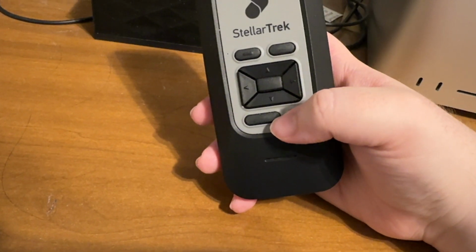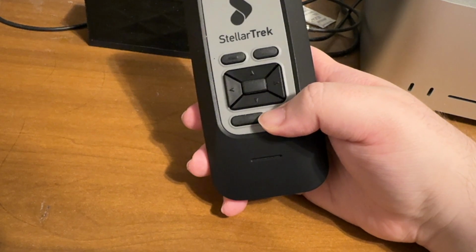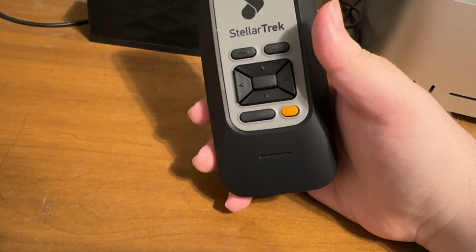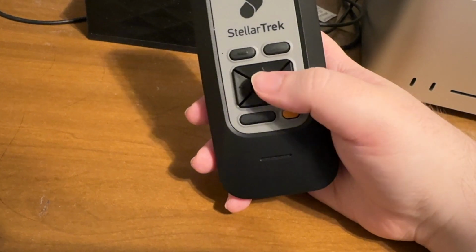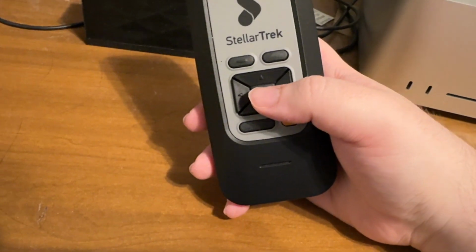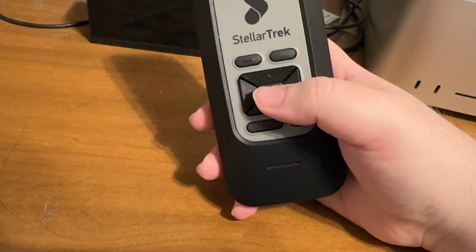Enter street name. And again, I'll hold down the voice button. Forbes. Forbes. Press go to confirm. Okay, let's see if that worked. Forbes. Searching. Select street. 1 street. Forbes Road, Braintree, Town of. Perfect. There's Forbes Road in Braintree. And I'll press the confirm key.